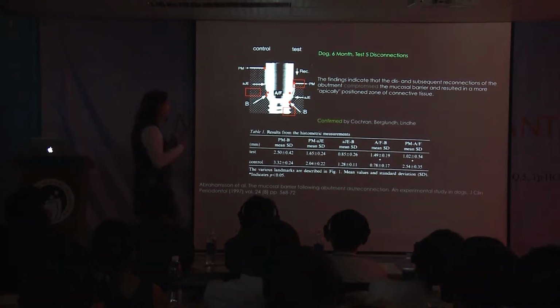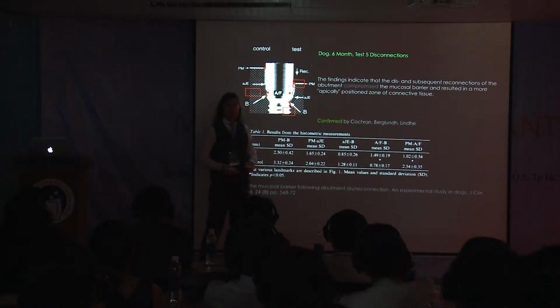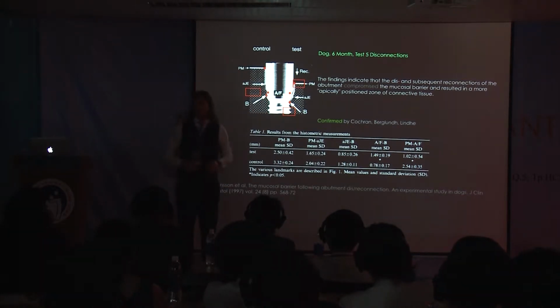What happens is that in the side where he was removing and replacing 5 times the healing screw, he had a resorption of the bone and the tissue had a recession. In the place where he didn't touch the connection and he didn't contaminate the healing screw, nothing changed. Tissue was very stable. Please remember what kind of connection this is. It's a very old connection, flat to flat, external hexagon.